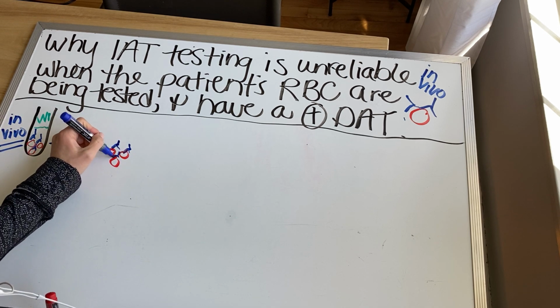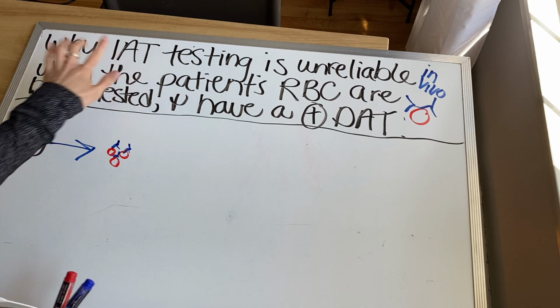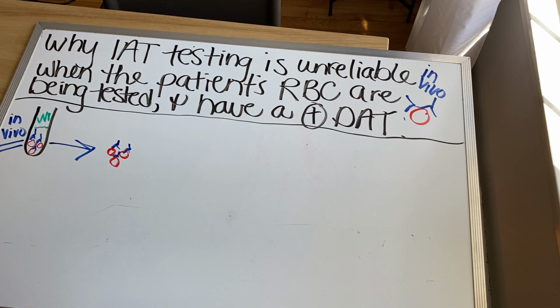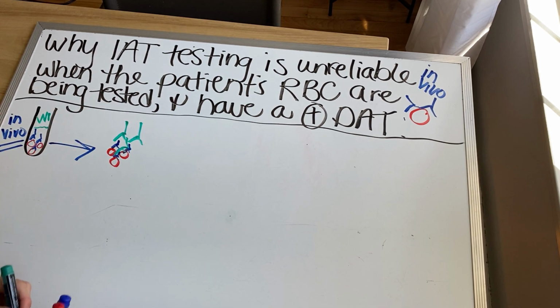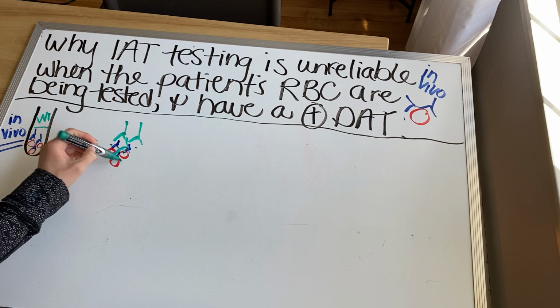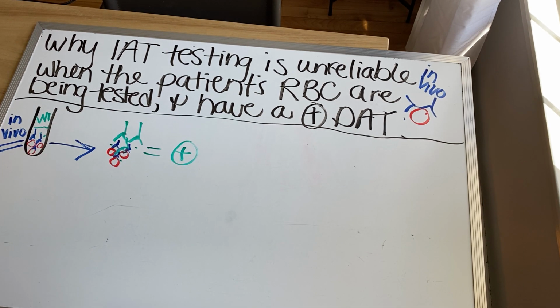We don't know that yet. We don't incubate. It's not indirect. It's just direct. Direct red cells. Are they coated? Well, let's find out. We're going to wash away any unbound, keep the bound, and add anti-human globulin. Anti-human globulin will react with these previously coating antibodies and give us a positive result. So now our DAT is positive. So we know that.